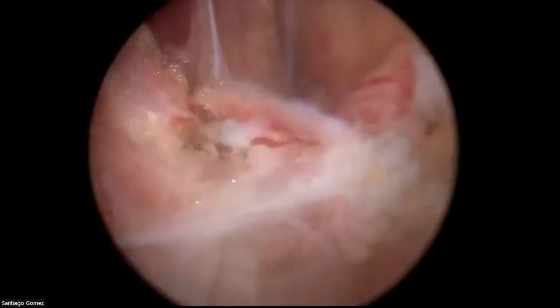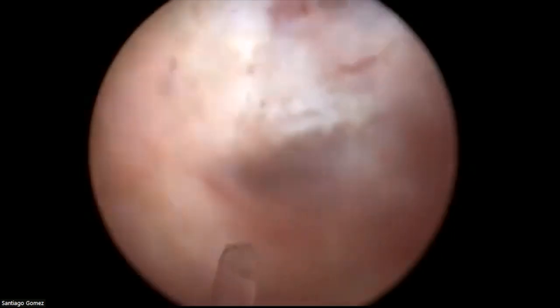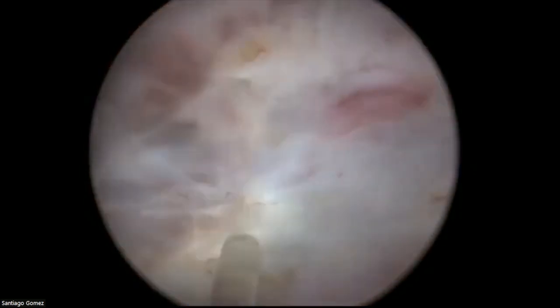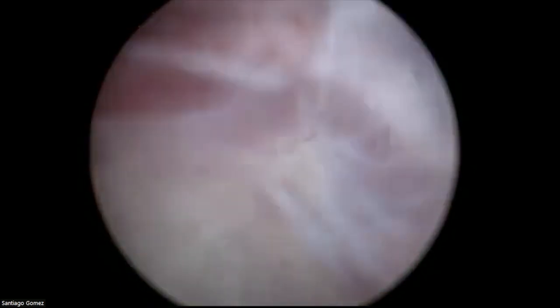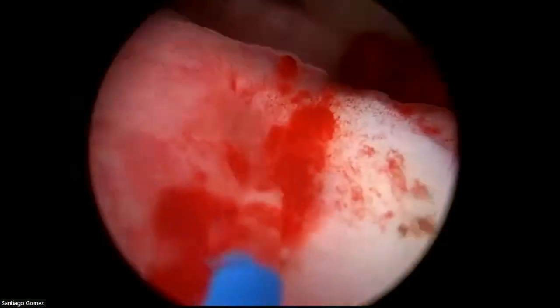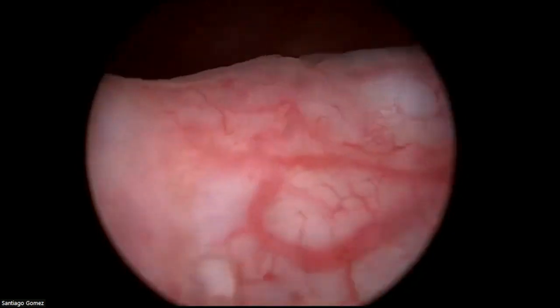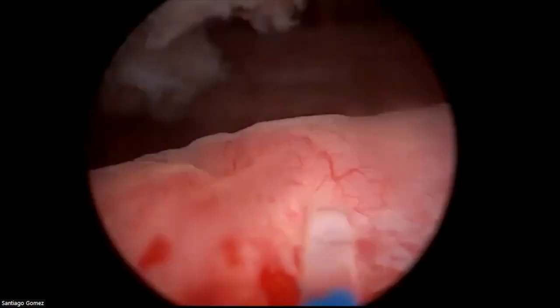I try to do hemostasis. Maybe in this case, I'll probably leave the catheter a little bit longer. Typically, we are quite aggressive removing catheters, but maybe in this case, it went slightly deeper there. So let's check the UO one last time. Here, this is good. We go to the other side. We saw it here.